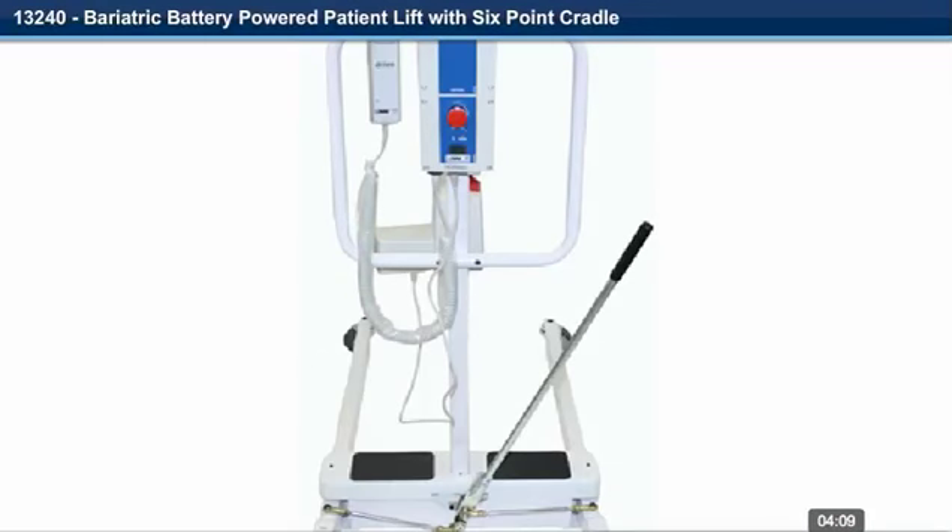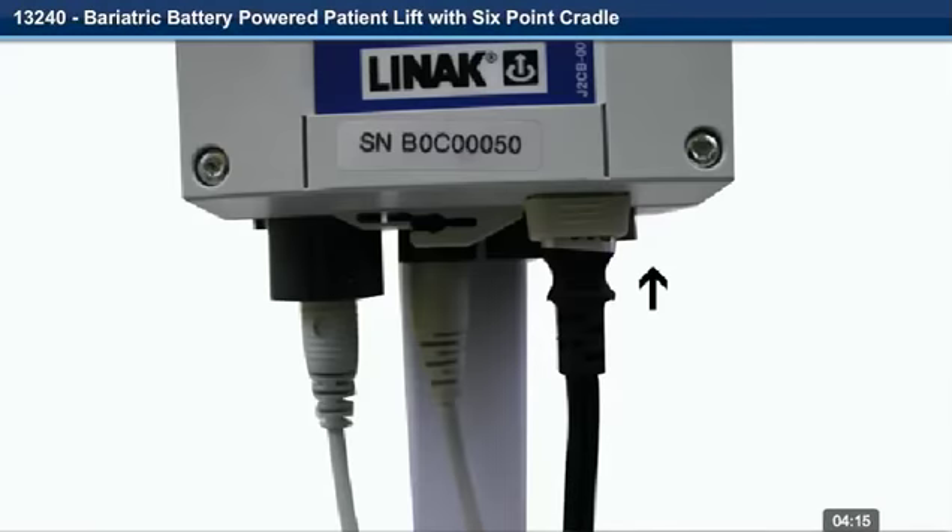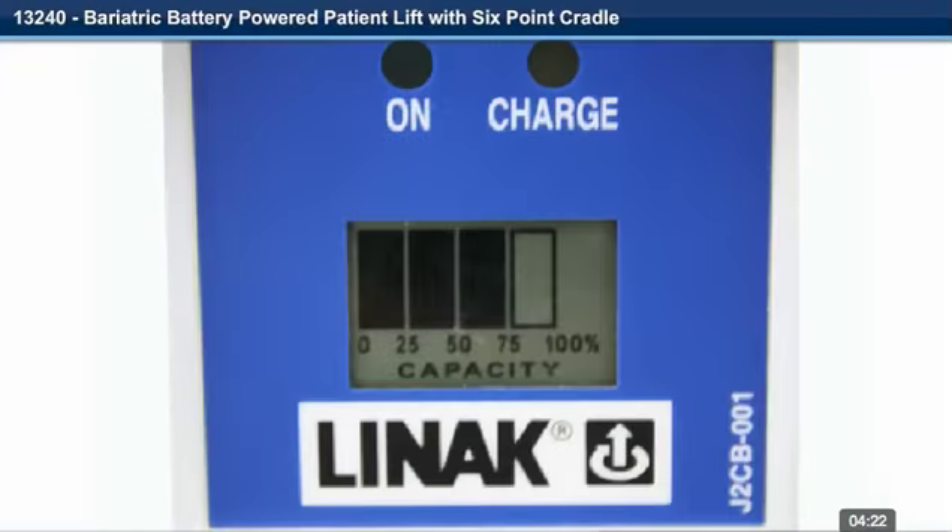Step 25. The lift is now fully assembled. Step 26. Charge the unit by plugging the charge cord into the controller and a wall socket. The amount of charge on the battery is indicated by the bar gauge on the front of the unit. The charger plug must be disconnected from the lift for the lift to work.